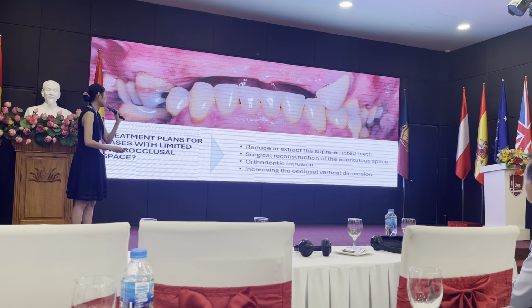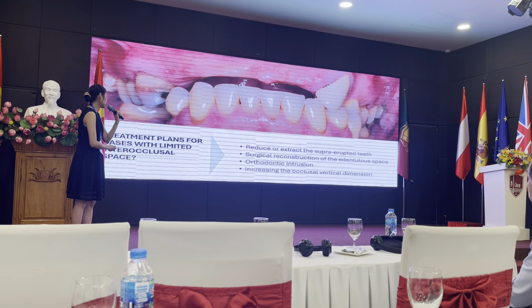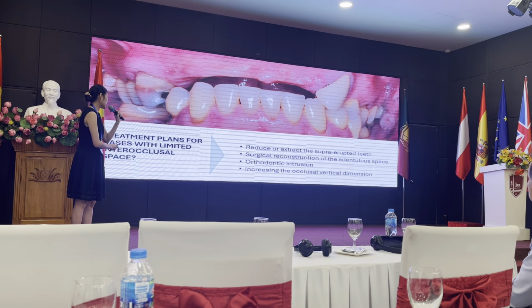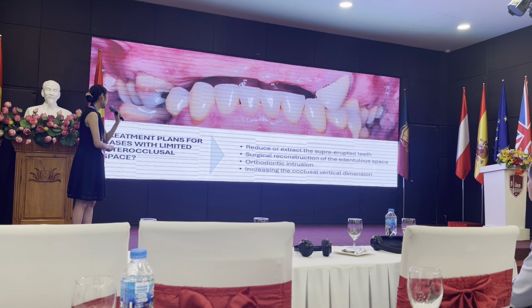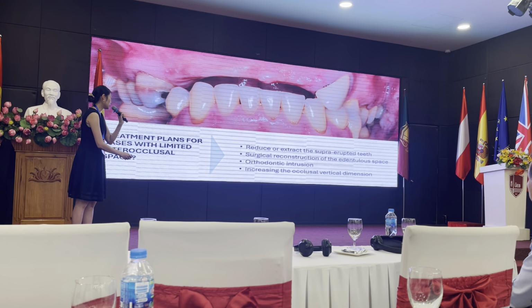And the next thing is sometimes you'll run into this kind of case. Đôi khi chúng ta có thể gặp những tình huống lâm sàng như này để chúng ta có một cái khoảng liên hàm rất là nhỏ như thế này. Các bạn có thể nhìn thấy rằng là cả toàn bộ cái nhóm răng dưới nó đang trồi lên, và gần như cái đường anterior curve nó bị đảo ngược.